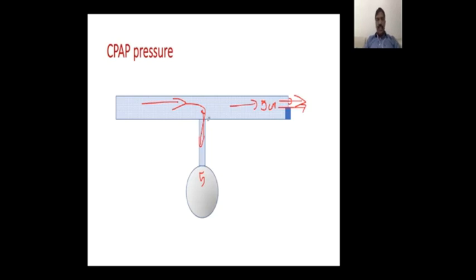Now, what do we need to generate pressure? We need gas flows. That means you need air oxygen flowing into this inspiratory limb. You need a nasal interface connected to the lungs. You need an expiratory limb, and to this expiratory limb we need an obturator or an obstruction to generate pressure in the lung and increase the FRC of the lung.